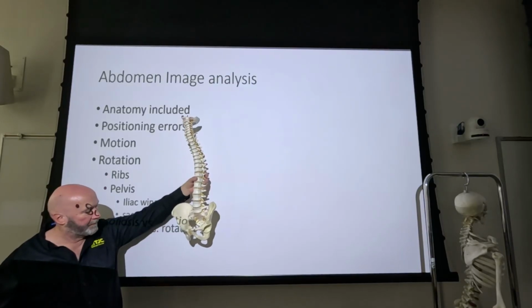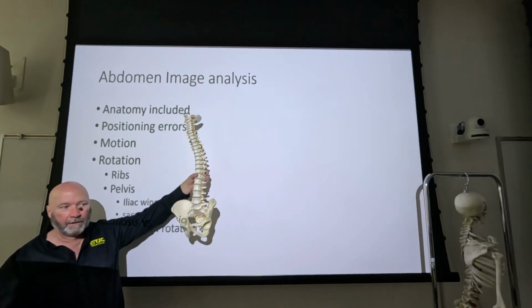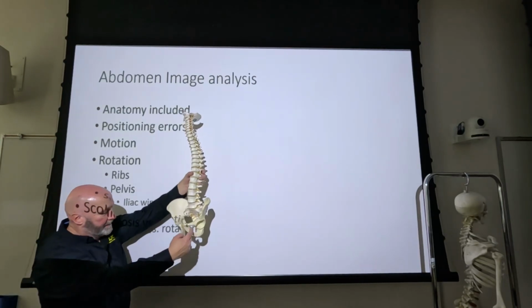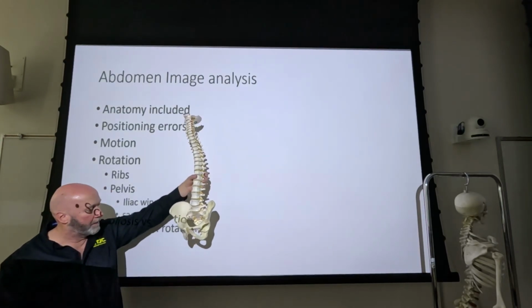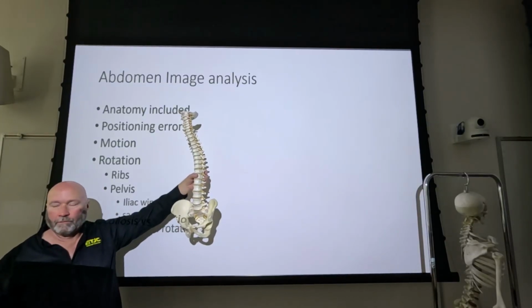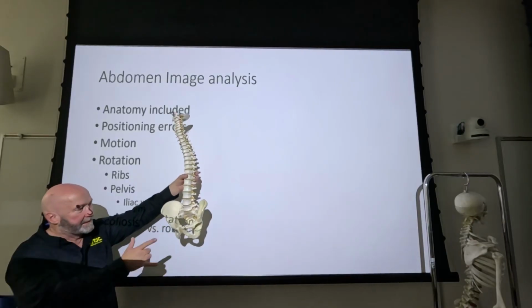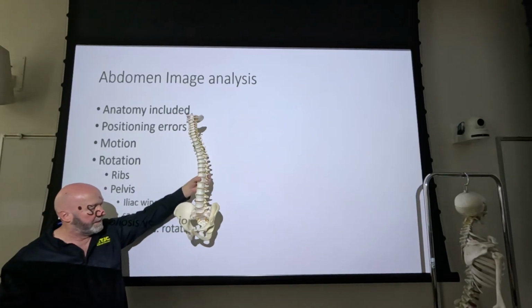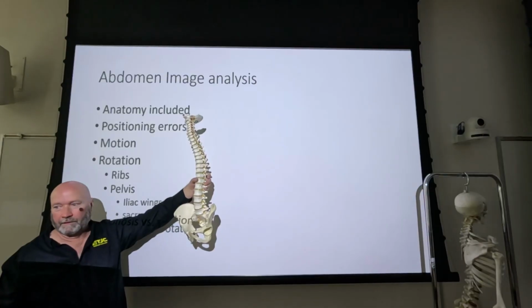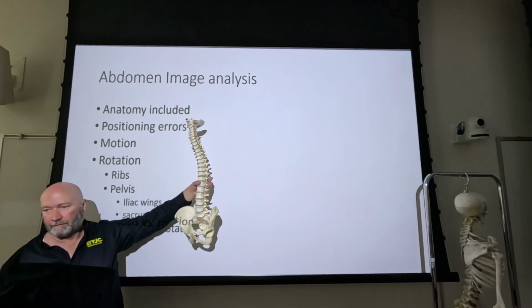What happened to the anterior pelvic bones? The downside went vertical, right? The upside, anterior pelvic bones opened up. What happened to the position of the sacrum within it? Went towards the elevated side, right? So the easiest thing to look at are these two. If one looks foreshortened, that's the elevated side, right? The patient rotated for whatever reason.